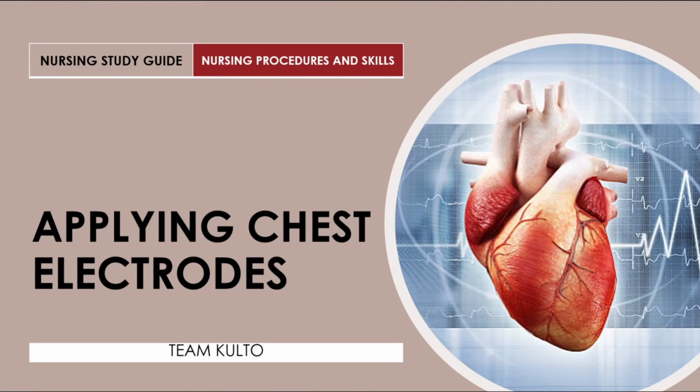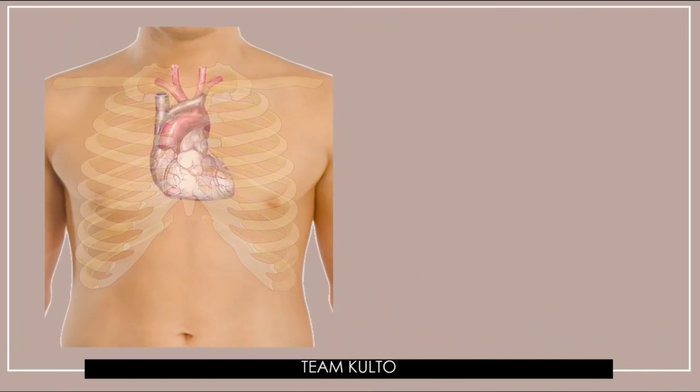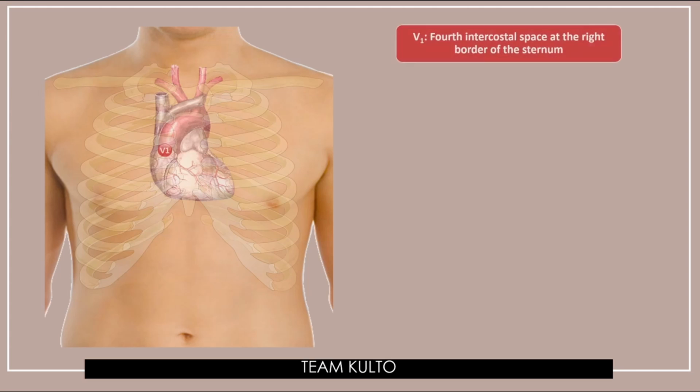Ito na, applying chest electrodes. Ito, padadaliin ko buhay nyo ha. Bibigyan ko kayo ng visual representation. Saan ba i-apply yung V1 to V6? Ito na tayo, okay? Huhu! Nakakahinga pa ba? Nakakahinga pa? Oo naman. Nurses tayo.